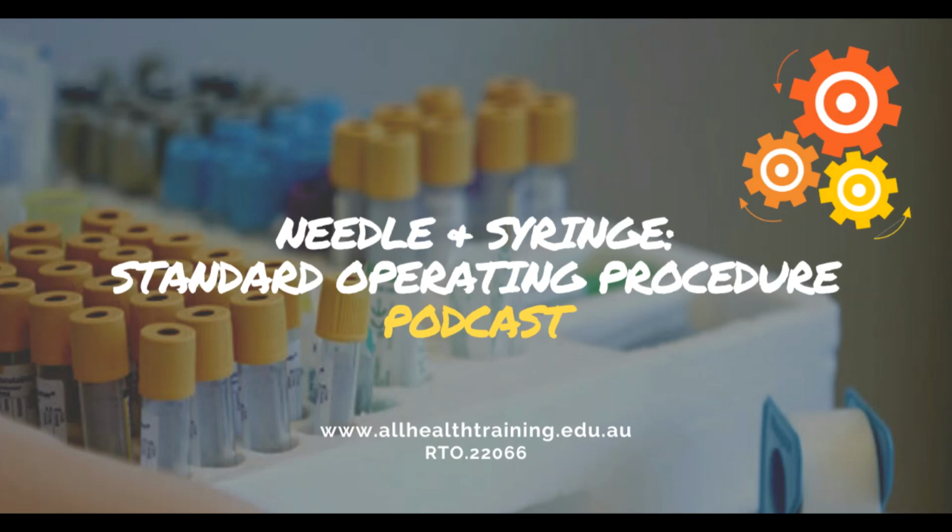Tidy up your workstation and complete your referral, barcodes and day sheet, placing the referral in the front pocket of your biohazard bag. Remove your gloves and sanitize your hands. Place your bloods in the processing area and wash your hands with soap and water. You are now ready for your next patient.